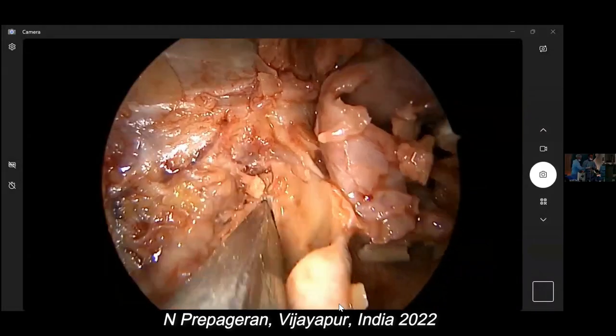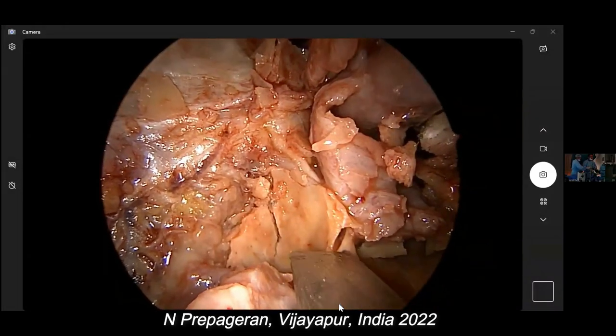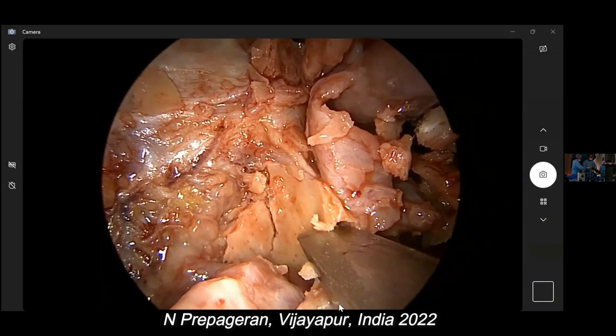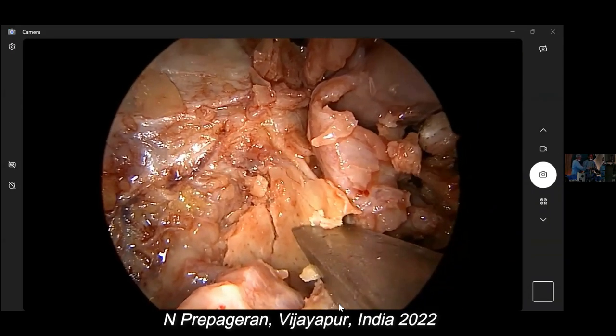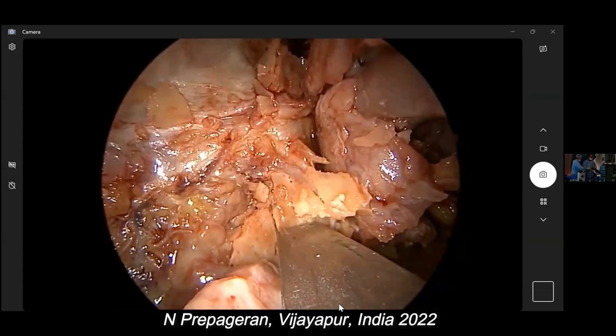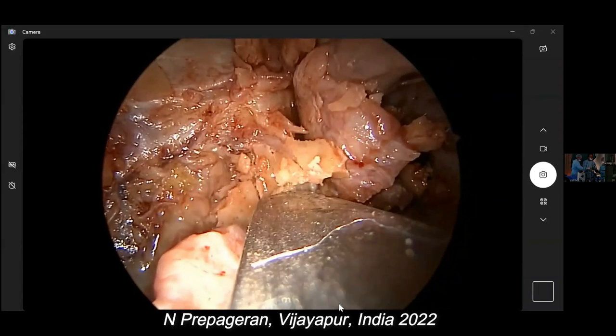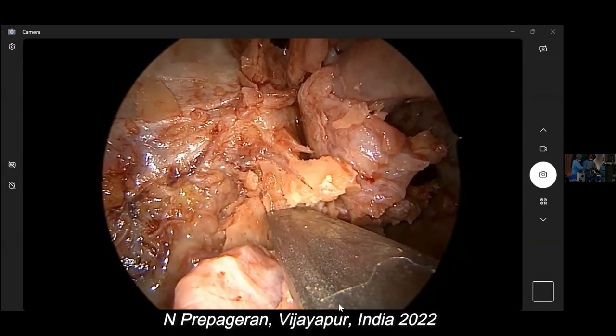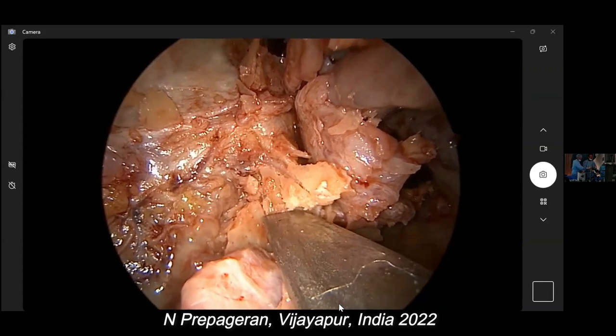Bang, bang. Usually with a flick it comes out. Bang, bang, bang. Don't bang my hand. I thought you liked me. Bang a bit more. See how hard the bone is? Bang.